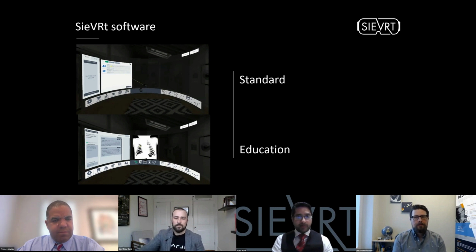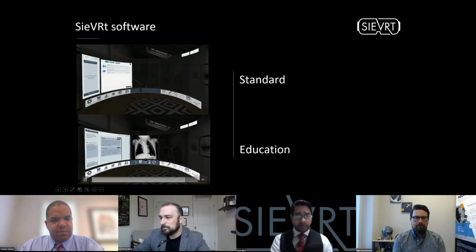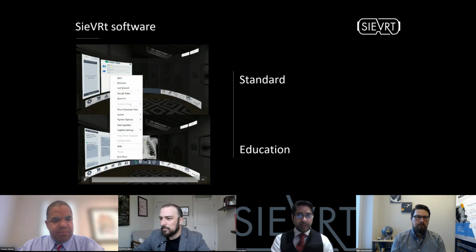When we thought about how to best educate residents, we thought, okay, what are the things that are important? Number one, access to an actual workstation is important, so you can actually go through the images and have the same workflows you would have on a regular workstation. The second thing is integration points for your teaching cases, things where you can really push to our system and be able to see those things. And then ultimately, mobility and the ability to collaborate with your fellow residents and with your attending.